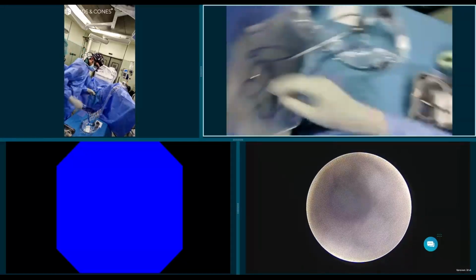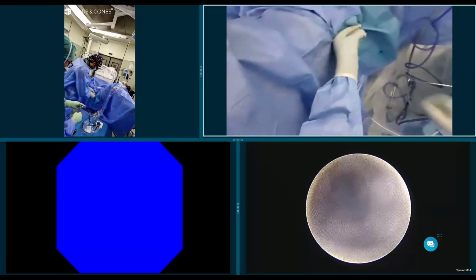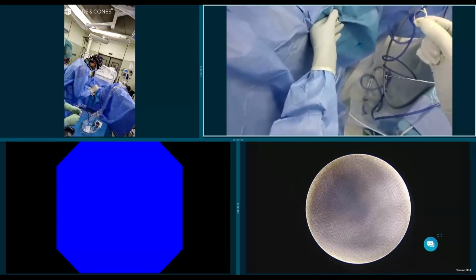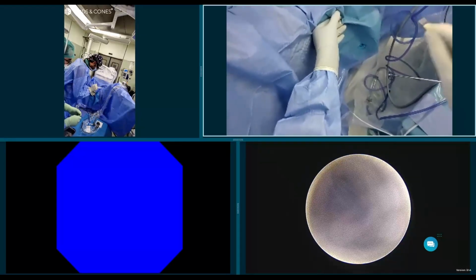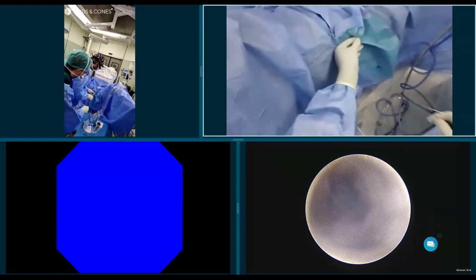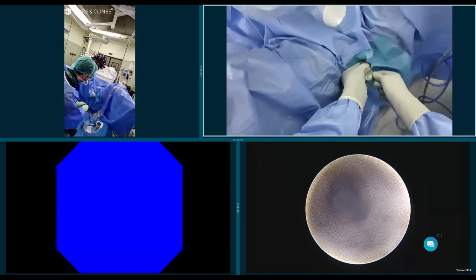Sometimes what I do is just that I cut the tip of the stent, even if it's a little bit incrusted. You can see here the color that has been changing around the stent. This may probably be some infection. This patient had a positive urine culture, and we gave her 1 week of antibiotics preoperatively.